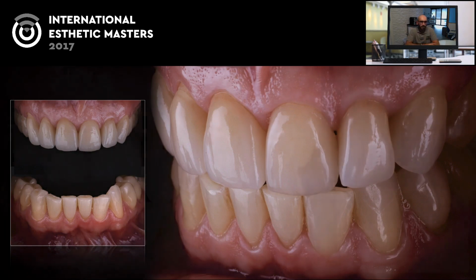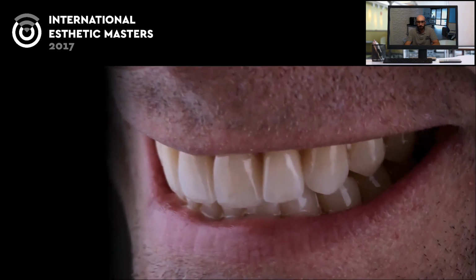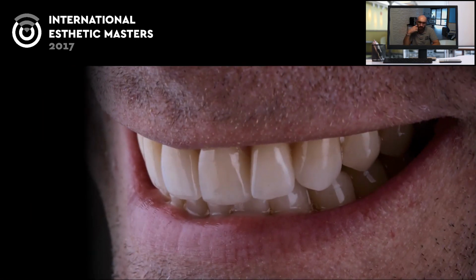This is the aesthetic integration. On the other side, you can see on the lower canine the small additional veneer, and the smile of the patient. This is the integration of the lip, the aesthetics of the anterior, of course. And this is before and after. So I think we can say that this is a good result, done always in an easy way, because when you press this restoration from the wax, you can get the same result as you planned on the mount. From the mock-up to here is not so difficult to get.